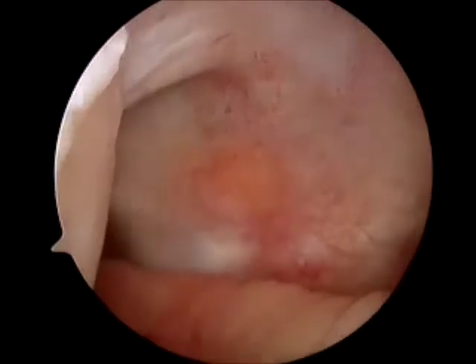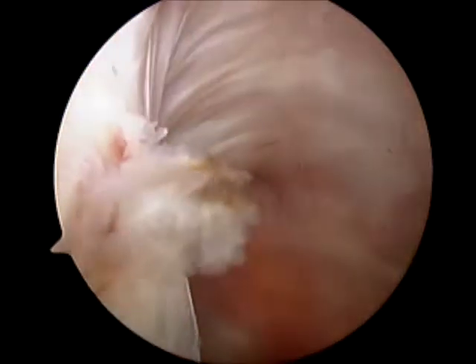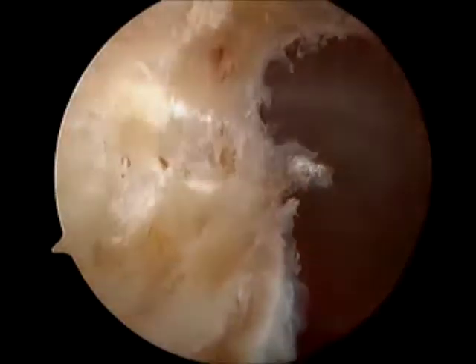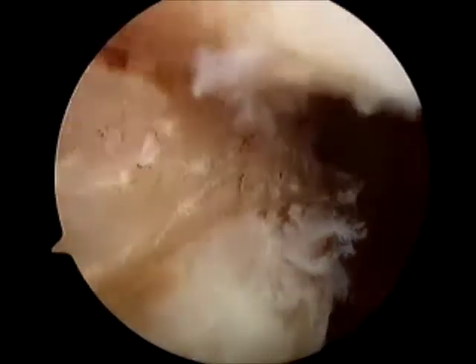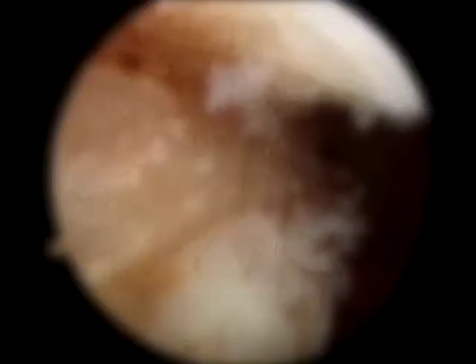We are careful not to clean off the entire stump of the ACL because we want existing fibers to remain in their anatomic location so we can use them for targeting. So we really would like to clean off only a swath through the middle of the footprint, leaving plenty of ligament left to be certain where the footprint is.